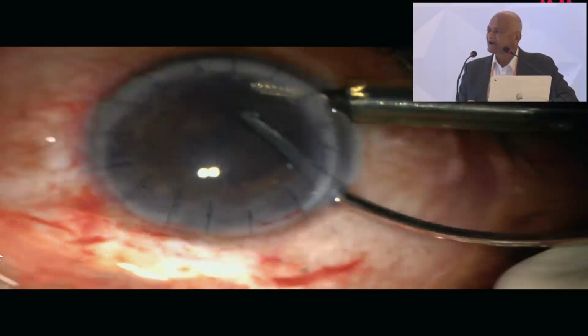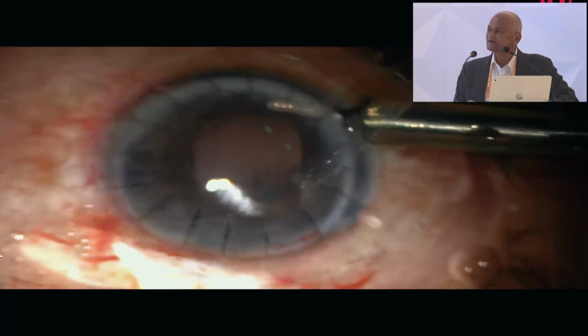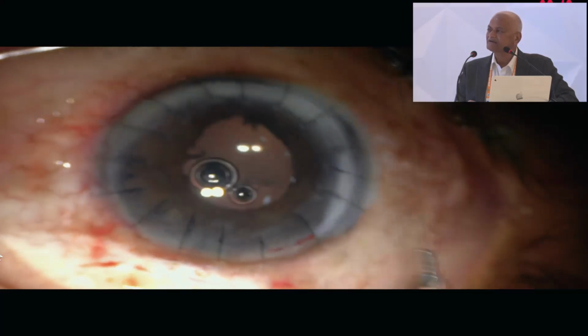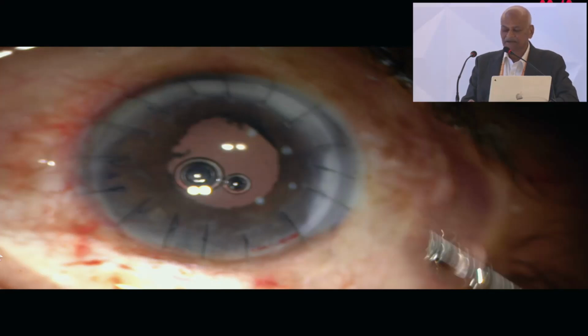Then I aspirate the cortex, and once I aspirate the cortex, the lens is implanted. I want the graft to remain clear and not be damaged, so I am doing it for that.